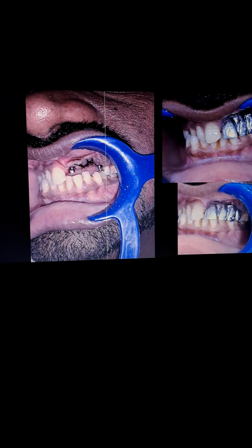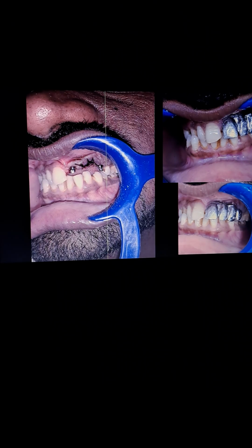Upon careful jaw relation, we were able to correct to some extent the involvement of the occlusion which was earlier visible, and therefore we obtained much more harmonic bite positions on the left anterior region. After the metal trial, the definitive prosthesis was given to the patient.